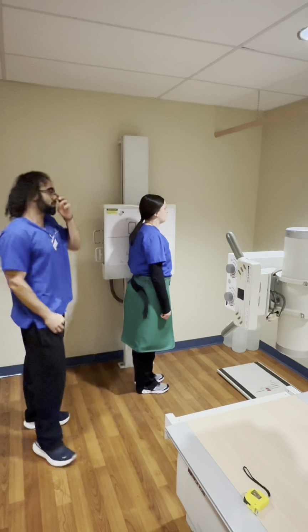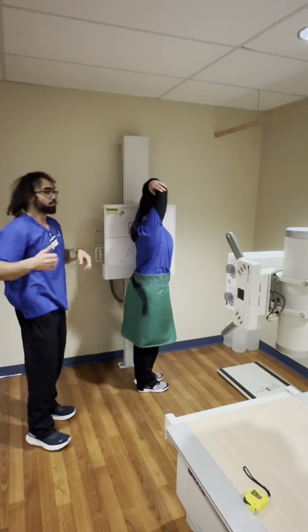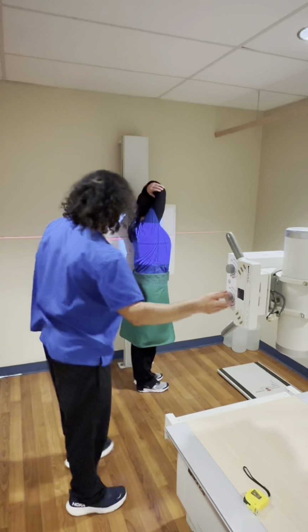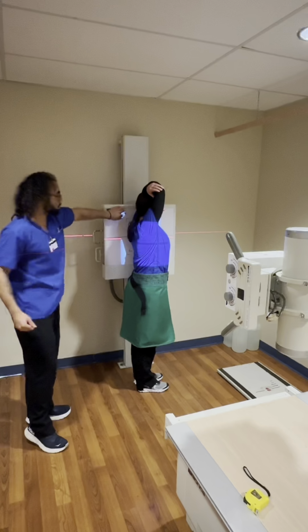So for this position, you're going to have the patient put their left shoulder up against their board, and you're going to have the patient bring both arms above their head if there's not a bar for them to reach onto. So we're still at the same centering point here, so not much should change at all. However, you might be able to collimate a little bit anterior to posteriorly, depending on the patient habitus. Then once again, you're going to want to mark the site of interest.